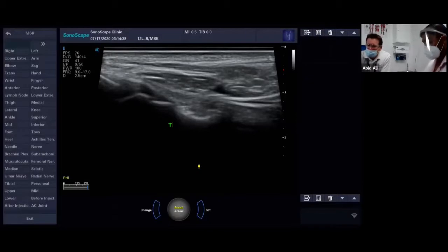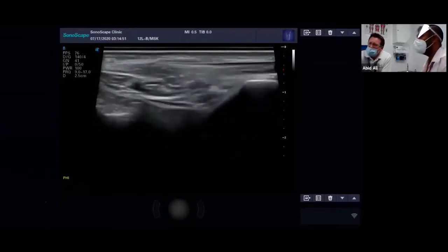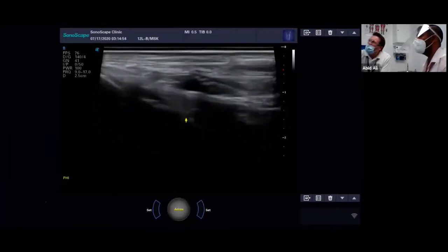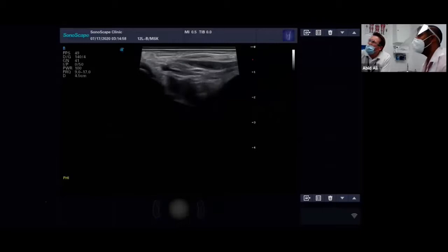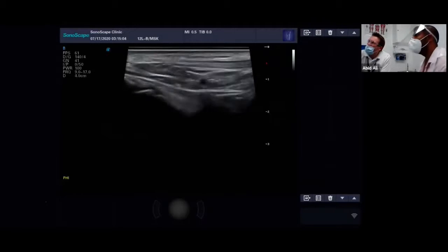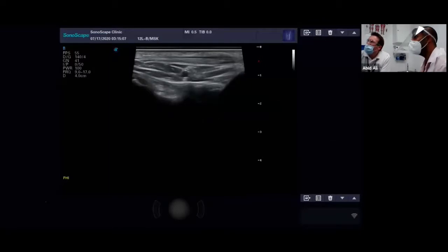Apologies, rest your knee on my foot on my knee there. That's the talus. You've got quite a big ankle. Can we come out a little bit? Make it more superficial. Oops, too deep there. Not too much, was that? I'm going to bring my focus down a bit. So you can see we're having to make quite a few adjustments here to really get this image nice and clear for you. That's better.